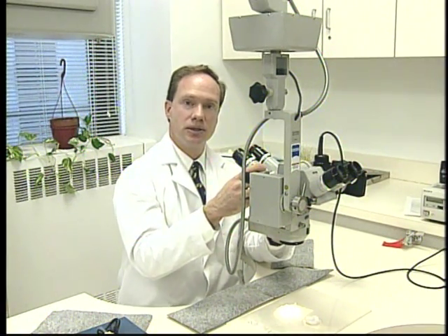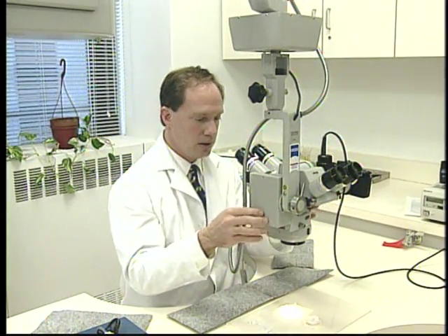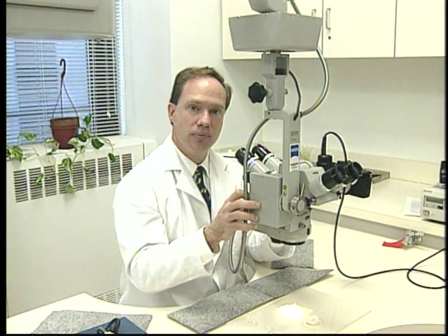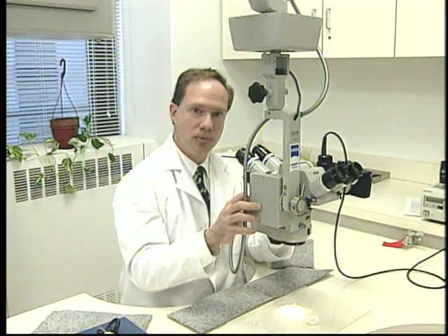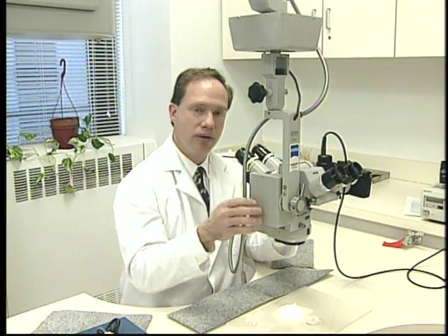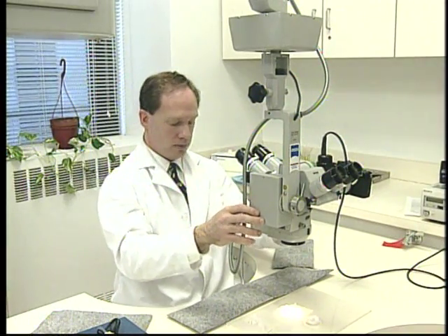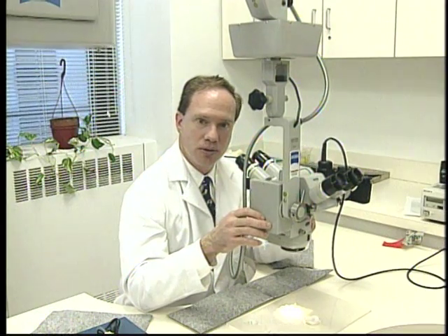Now, to actually get down to looking through the microscope, first you want to make sure that you zoom in all the way to the highest magnification possible. In this way, when you are focused at the highest magnification, you can zoom out and everything should be in focus.